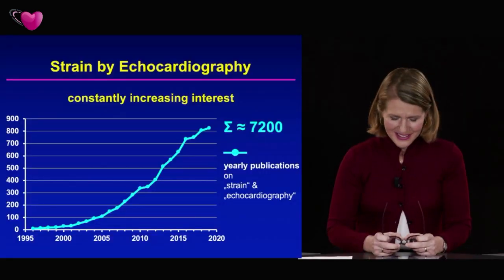Sorry. Thank you. So there is an immense interest in the audience about atrial strain. We have to remember the title of this webinar, how and why to measure. So now comes the key question for you, which has also come from the audience: why measure atrial strain? Yes, this is a very valid question. I must say I tried to answer the how, and I focused a bit on the how because this is the easier part to define. If there is added value of left atrial strain remains to be determined.